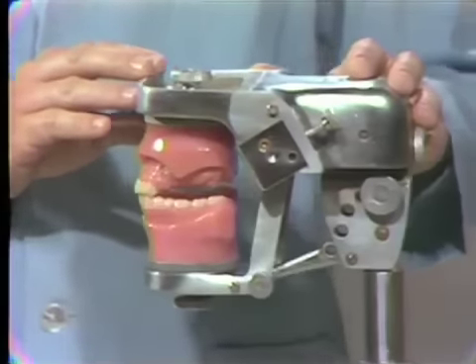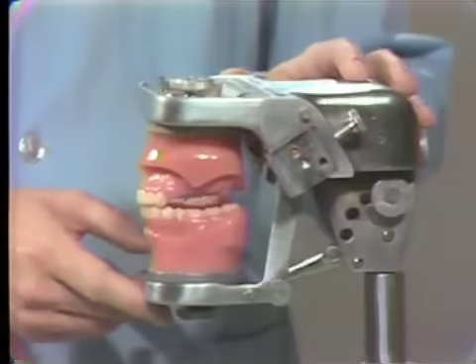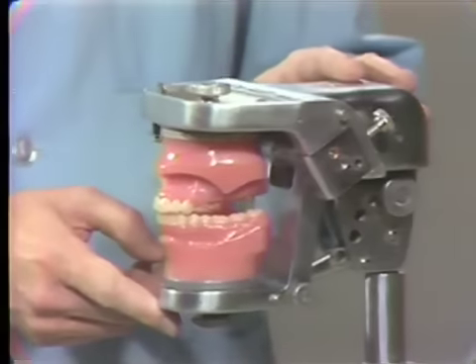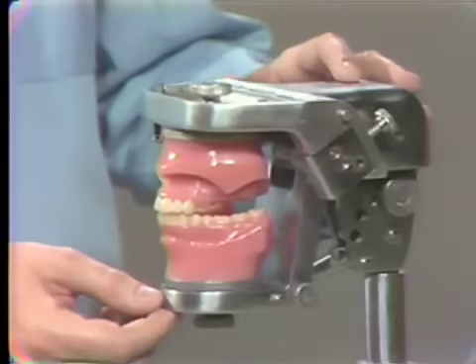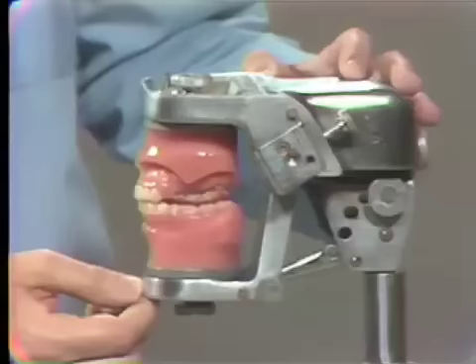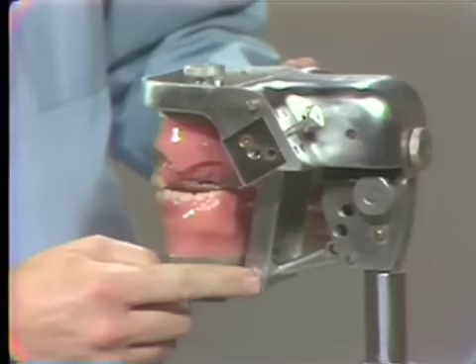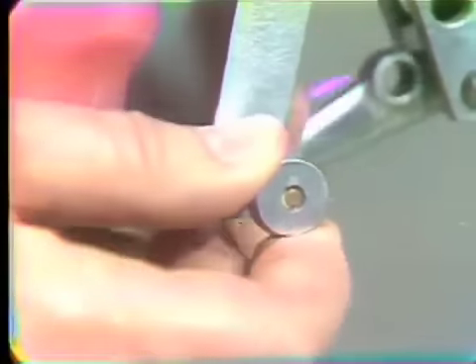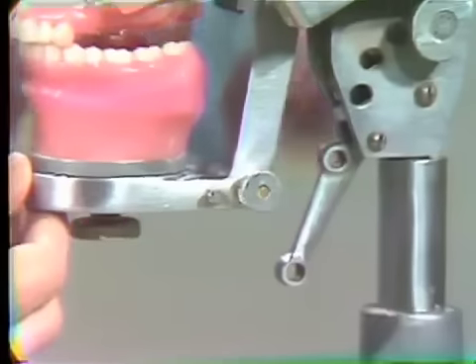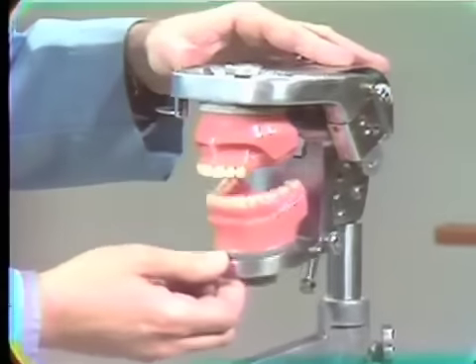As you'll notice, there are only two mannequins that have the proper articulation, and each one of you has to transfer this relationship to your articulator. A small pin in this area can be released by just pulling it out, and then the lower mechanism representing the mandible can freely move back and forth.